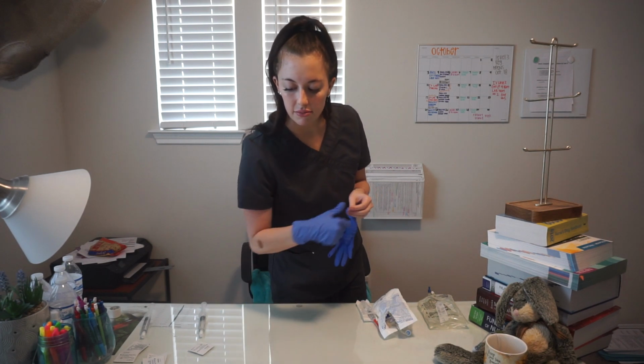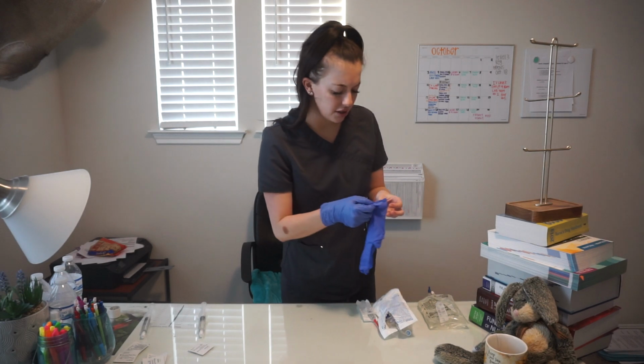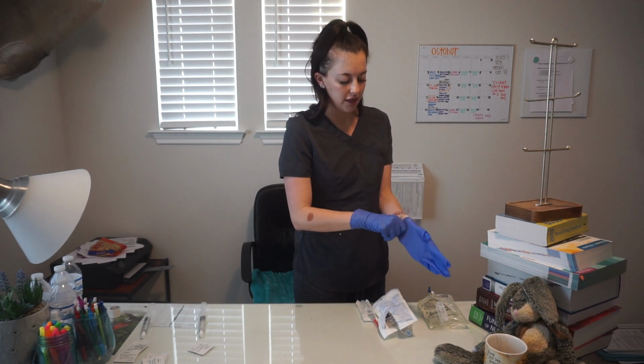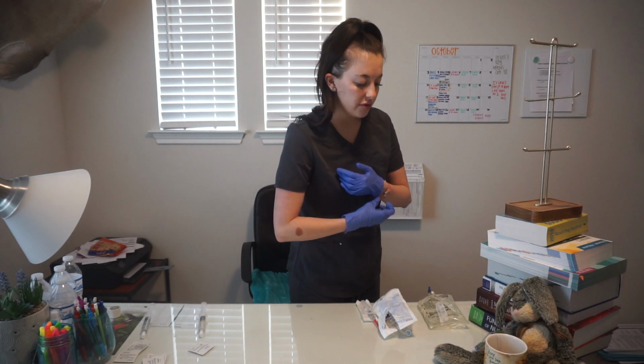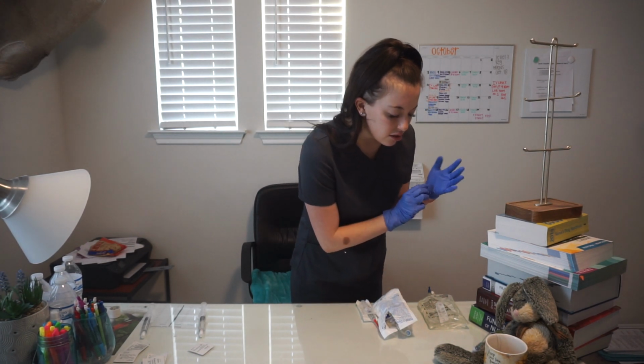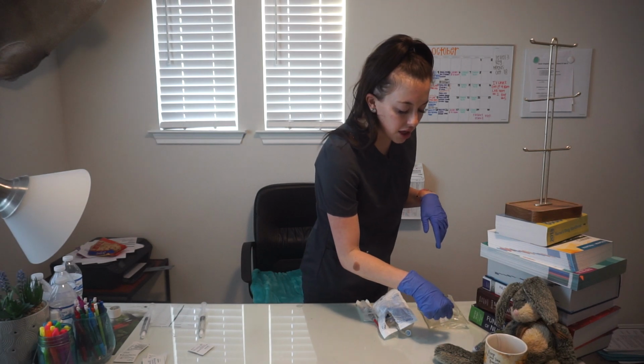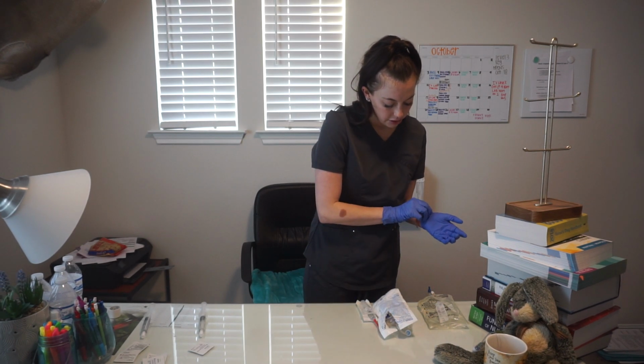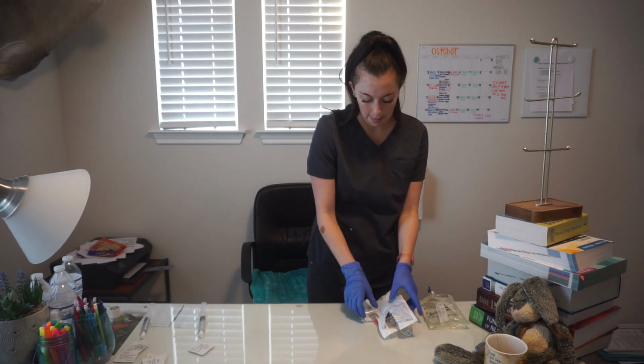Okay. Mr. Moore. Alrighty. And do you have any allergies? No allergies. Alrighty. I'm just going to double check your MR number really quick. And I'm also going to check the IV site for inflammation and infiltration. And everything looks good. Okay.